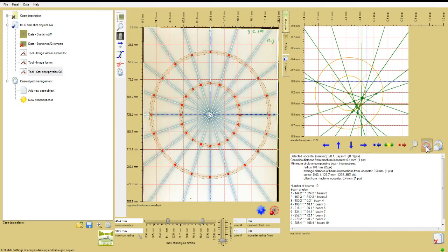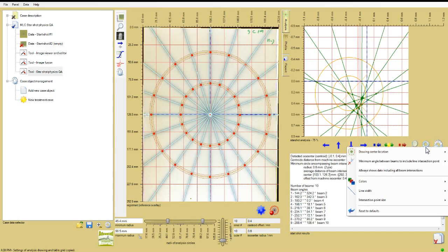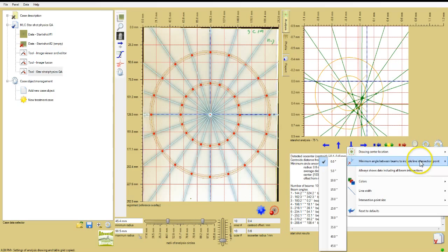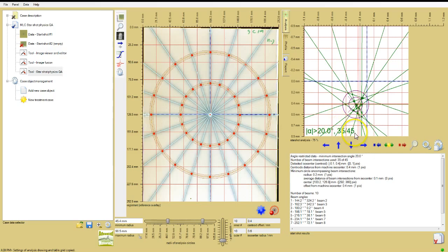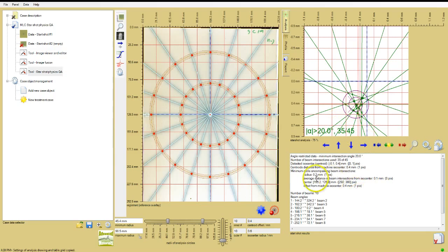The 10 beam lines in the gantry starshot are 18 degrees apart. Right-click the options icon, the one depicting mesh gears under the chart in the analysis window, and choose minimum angle between beams and set it to 20 degrees. This eliminates 10 out of 45 beam intersections from the analysis, but improves the measurement from the remaining intersection points, and the radius of the minimum circle is reduced from half a millimeter to 0.2 millimeters.